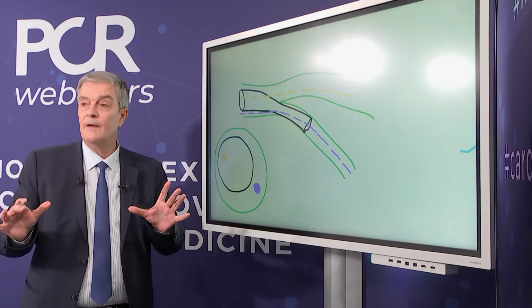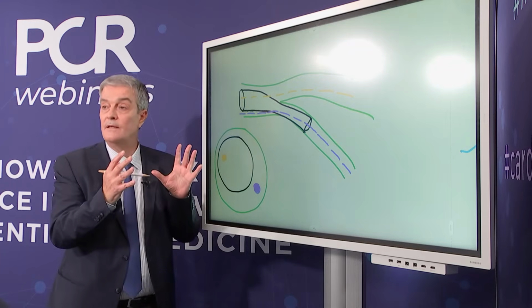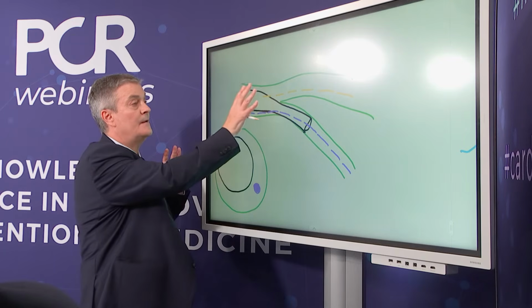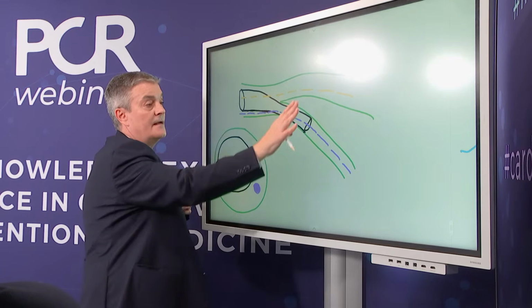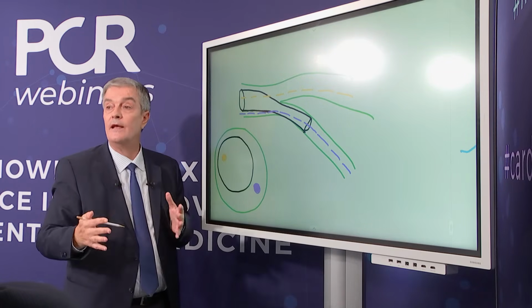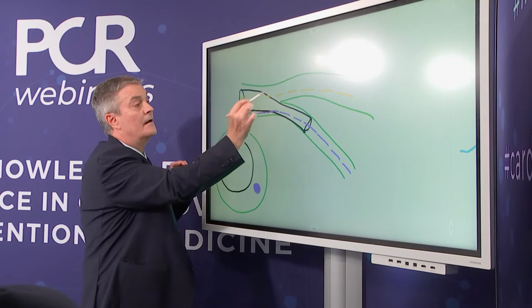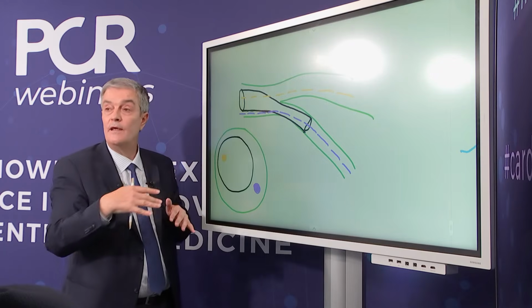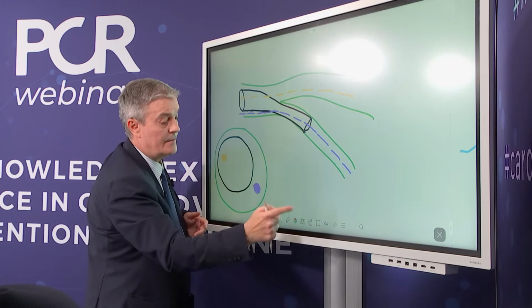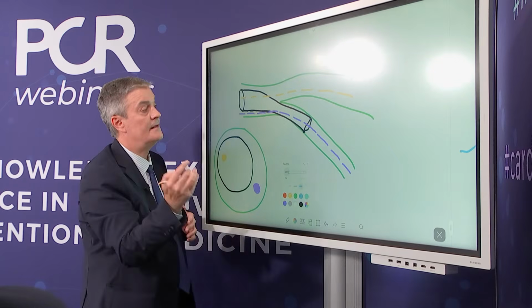Yeah, just to summarize for our colleagues. When we have deployment of a stent, especially in the left main, there is a huge discrepancy in diameter between the left main and the two daughter vessels, the LAD and the circumflex. This discrepancy in diameter is corrected by adequate proximal optimization. If we don't deploy a larger balloon to fully expand the stent, what can happen? Option number one, and I will take a different color maybe to enhance understanding.